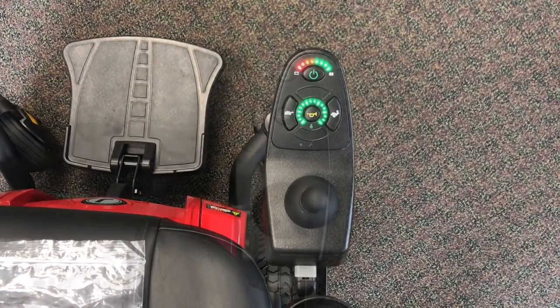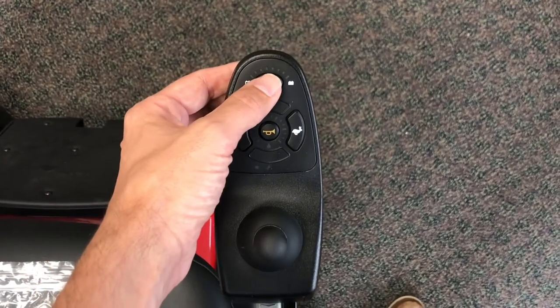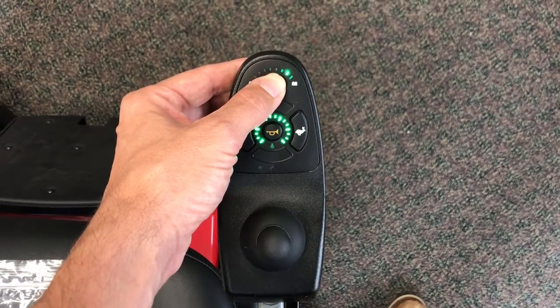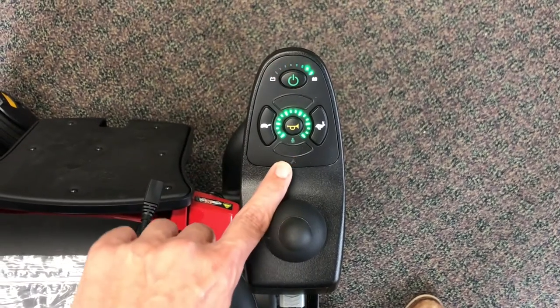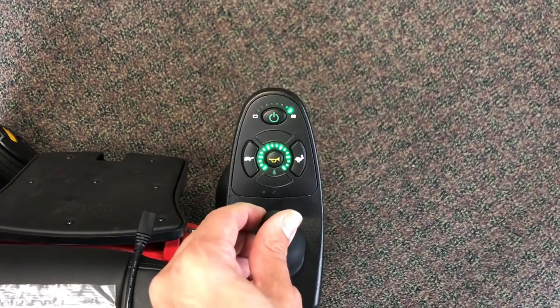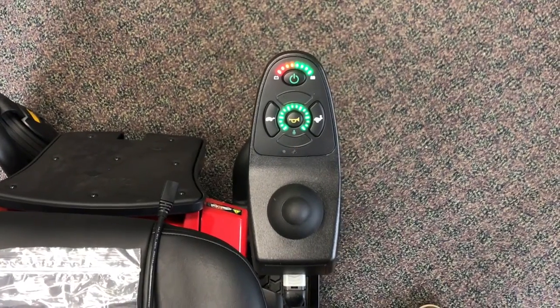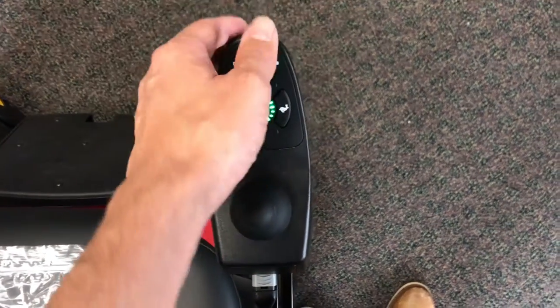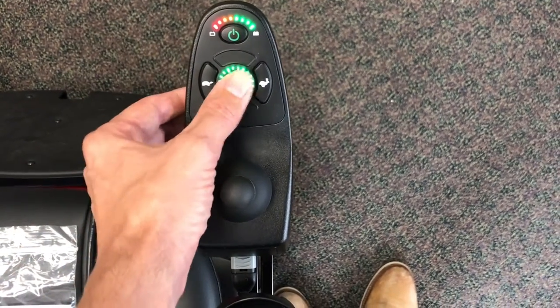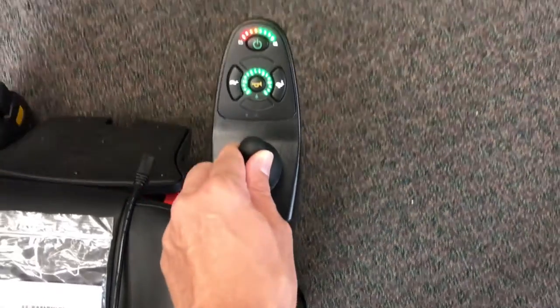Also, if you press that power button and keep pressing it after you've initially turned it on — hold it down for three seconds — it will go into drive lockout. This locks the chair so that nobody else can use it, and you'll see that little wrench symbol flashing. To unlock it, you turn it off, and when you turn it back on, press the horn button twice right after turning it back on. That unlocks the joystick and now the chair will work.